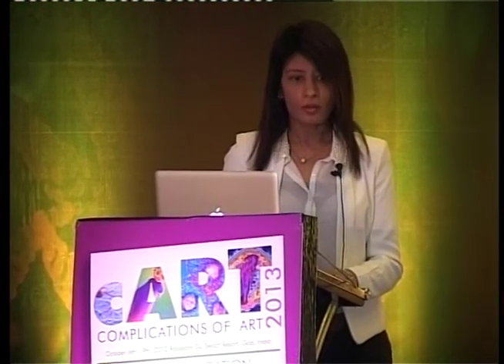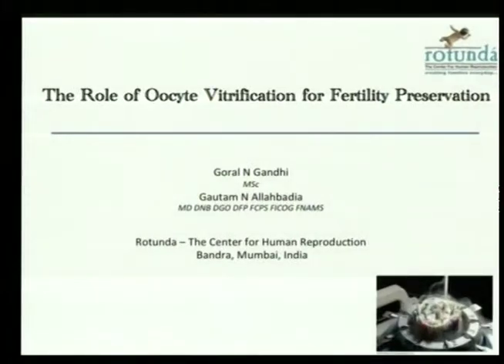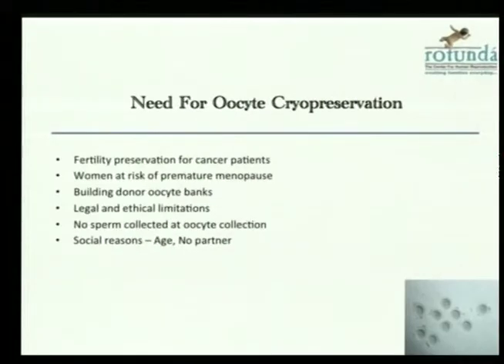The title of my talk today is the role of oocyte cryopreservation, oocyte vitrification for fertility preservation. As all of us know and all of us have learned, there are many reasons why we need to have an optimum cryopreservation program for oocytes in our laboratories. Reasons such as fertility preservation for cancer patients, women at risk of premature menopause, building donor oocyte banks, legal and ethical considerations in certain countries which do not allow embryo cryopreservation, no sperm collected at oocyte collection, and social reasons.